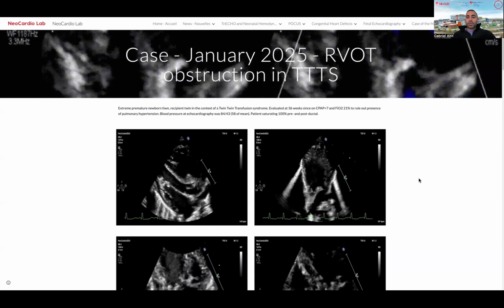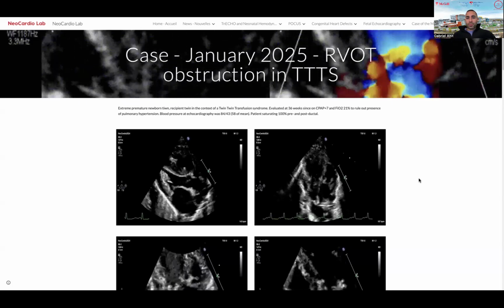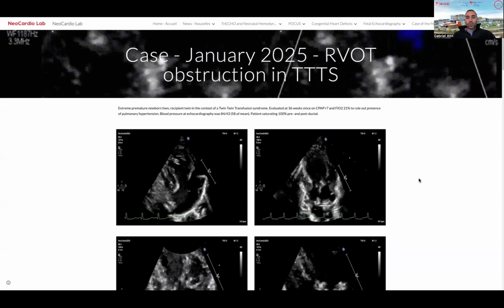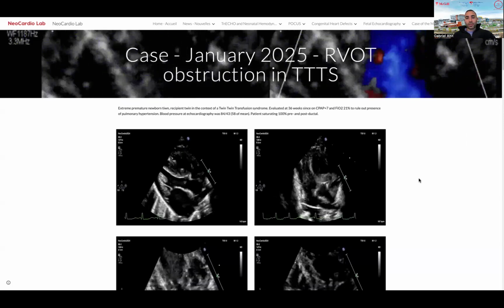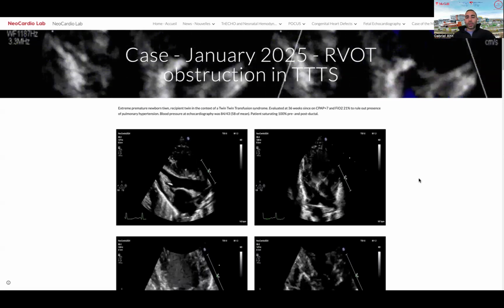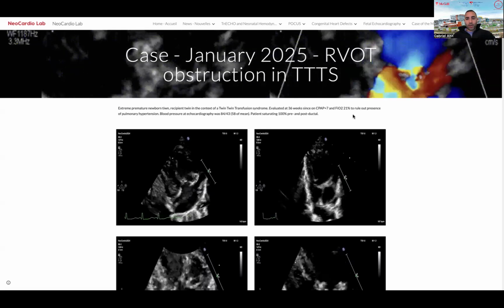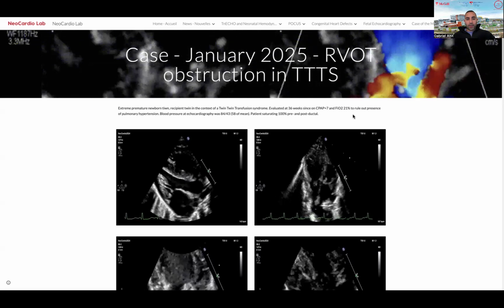Really briefly, this is the typical case of a baby who was born in the preterm range with appropriate growth during gestation and postnatally, and for which we were involved in the screening for pulmonary hypertension at 36 weeks, because this patient was still on some degree of respiratory support, so CPAP of 7, with no oxygen support, actually, in room air. And we were asked to rule out pulmonary hypertension by echo.